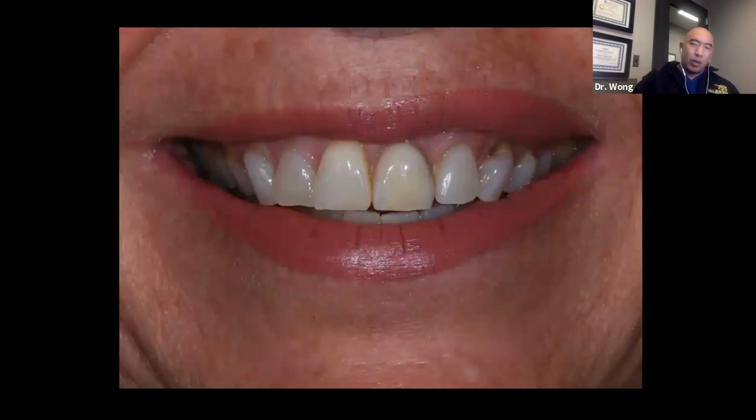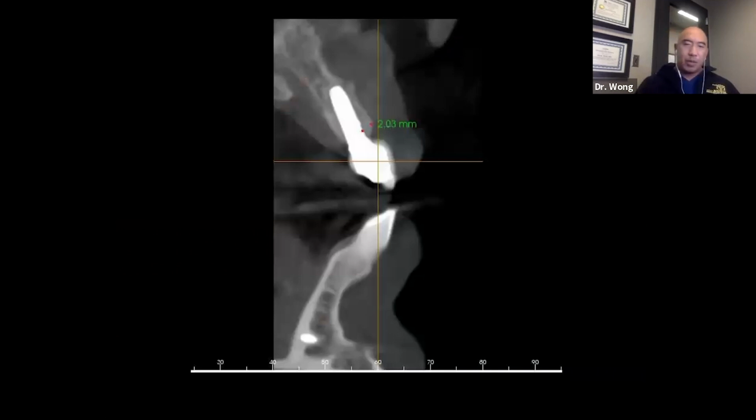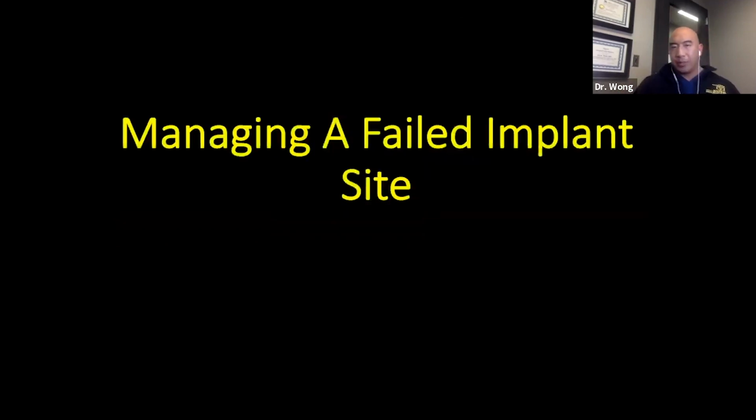Now, once again, we did all of this, went through all this trouble because of the way her upper alveolar process was shaped. And here we have the implant. You can see, once again, it misses the nasopalatine canal and the incisal canal, and then you have plenty of bone to the facial aspect of the implant. So this is more restoratively driven dentistry.